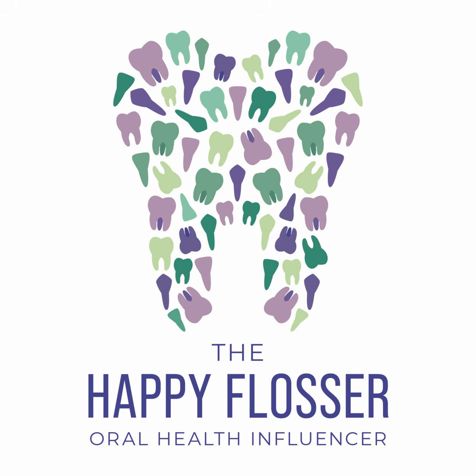The other thing is you want to go prepared. You want to work very quickly and efficiently, but you also want to be able to get a quality image. So be prepared with where you're going, what you're doing. Have your RINN completely set up correctly before you approach your patient. Provide your patient with compliments. Saying to your patient you're doing a great job goes a long way at helping keep them calm and committed to the process as you're taking a full series of x-rays.